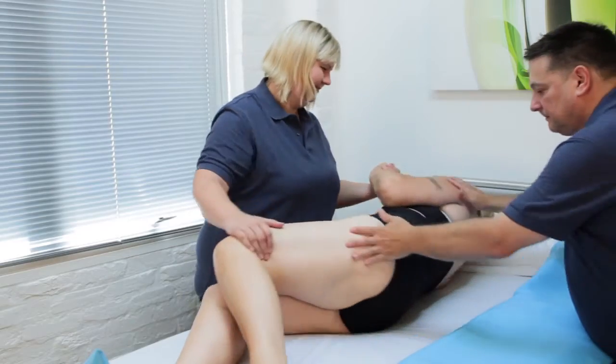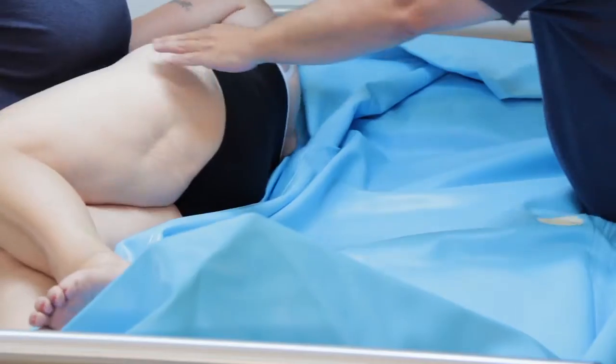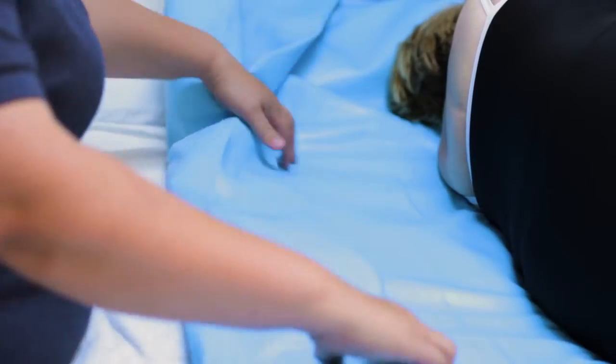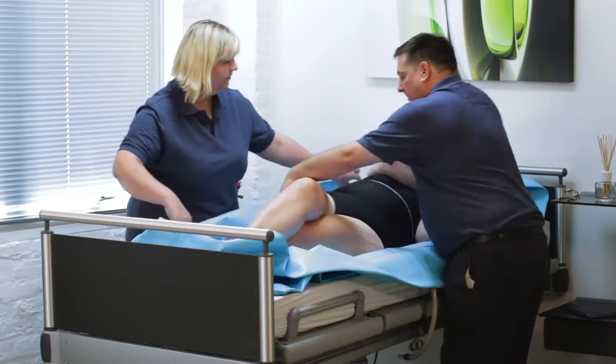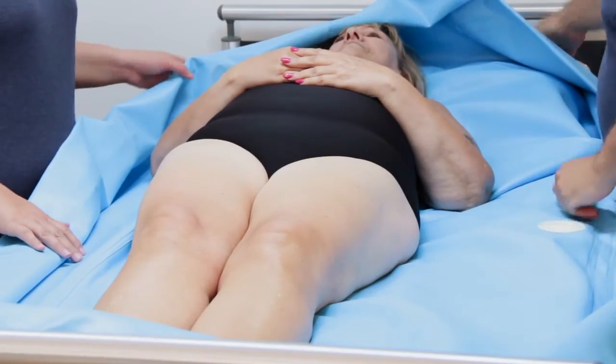Roll the patient onto their side. Roll the shower tray close to the patient's back. Roll the patient onto the shower tray. Unroll the shower tray the other side. Roll the patient back into a neutral position. This is the same technique as inserting a sling or changing a sheet.